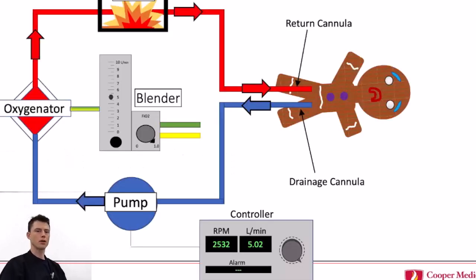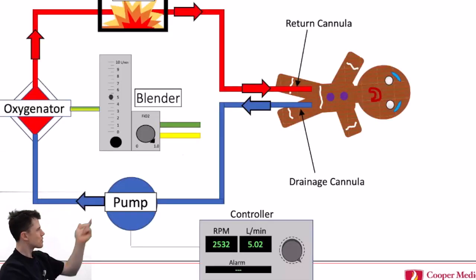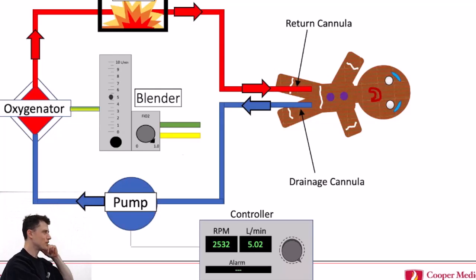We'll talk about the circuit. We'll talk about the components of the circuit, and you'll get a chance to go hands-on up here. For those of you who've been at the bedside, you may be well familiar with these, but we'll talk about specific things and how we manipulate it to achieve what we want.